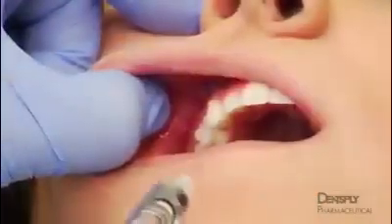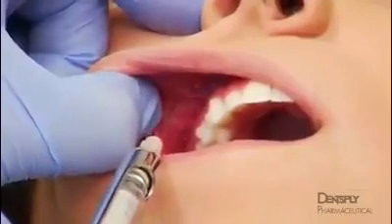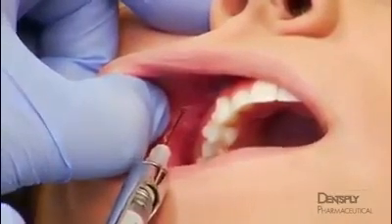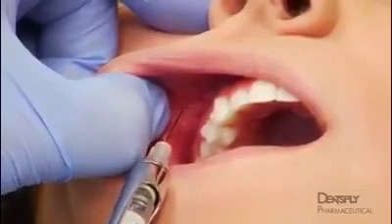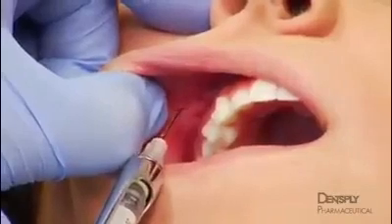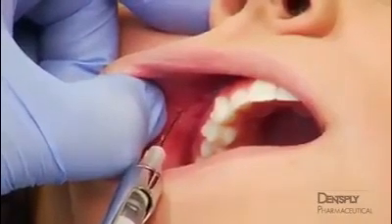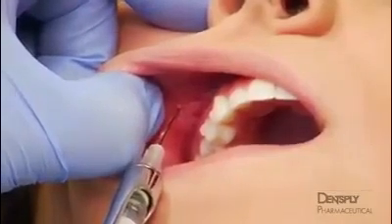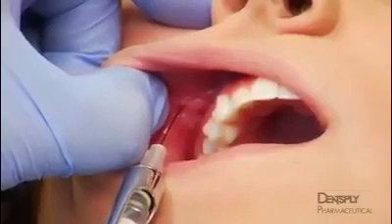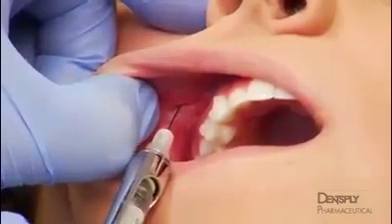The needle is then inserted vertically about 5 millimeters lateral to the second premolar and parallel to the long axis of the tooth with the bevel of the needle towards the face. The orientation of the needle as seen from the front of the patient should mirror a vertical line, defined by the medial aspect of the pupil and the infraorbital foramen. For this and other injections described in this program, a few drops of anesthetic expressed as the needle is slowly advanced is useful to minimize discomfort.